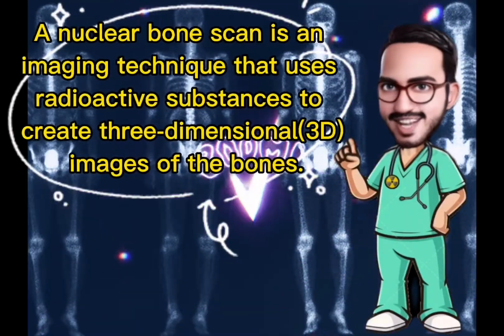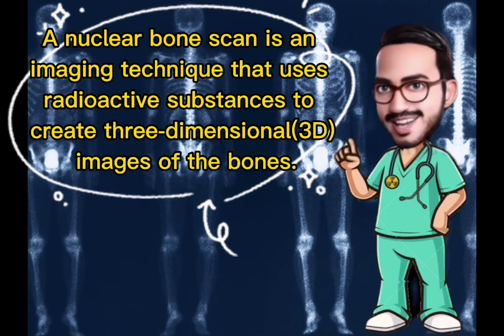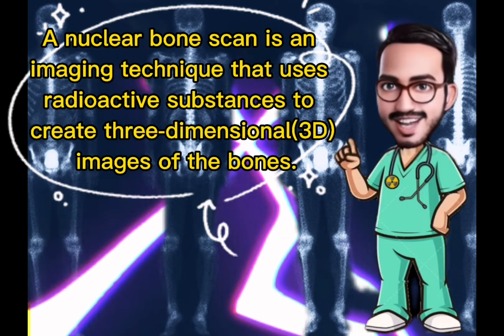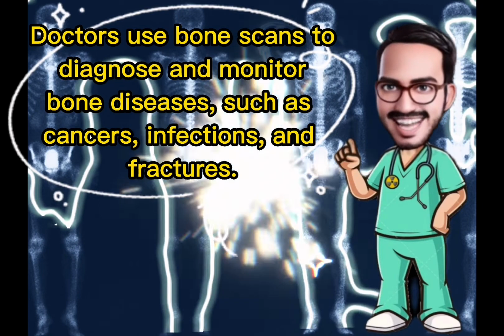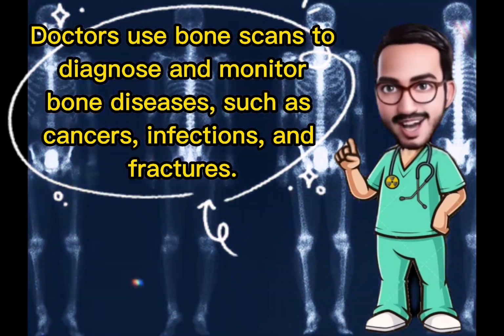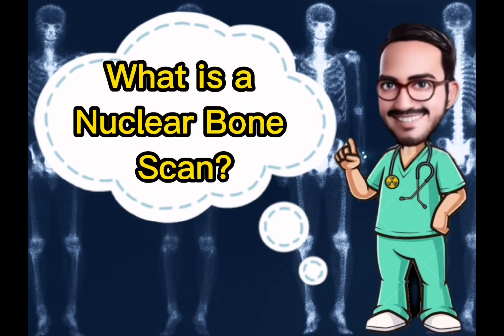A nuclear bone scan is an imaging technique that uses radioactive substances to create three-dimensional images of the bones. Doctors use bone scans to diagnose and monitor bone diseases such as cancers, infections, and fractures. What is a nuclear bone scan?